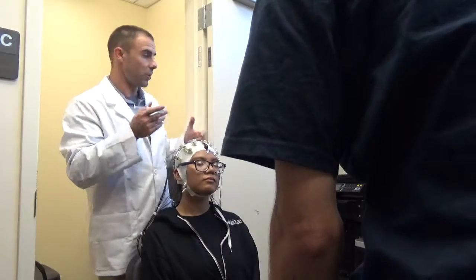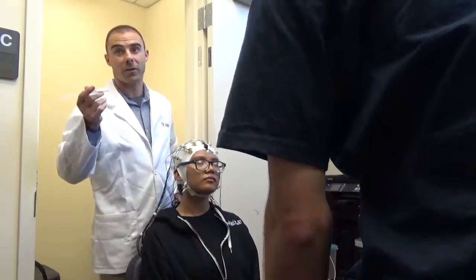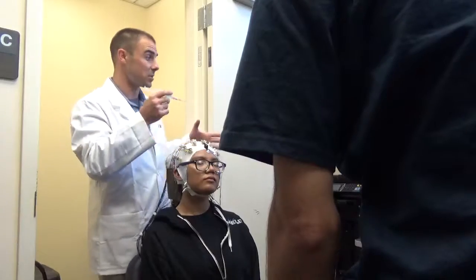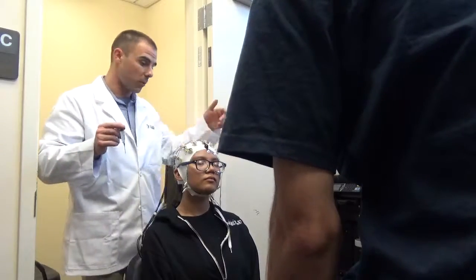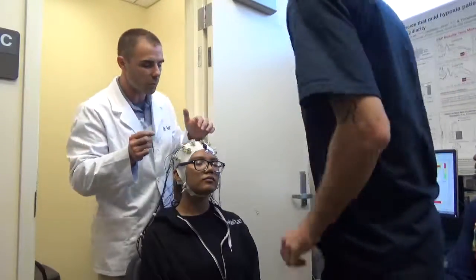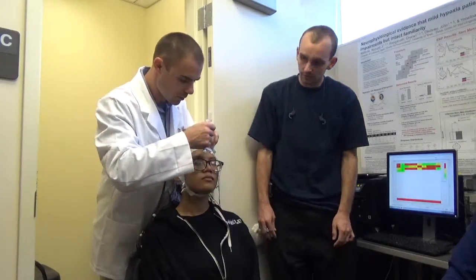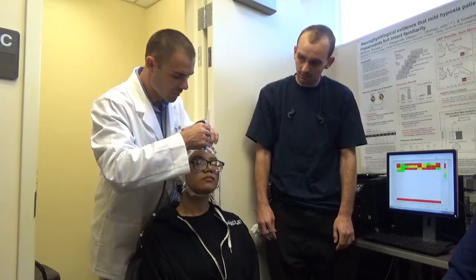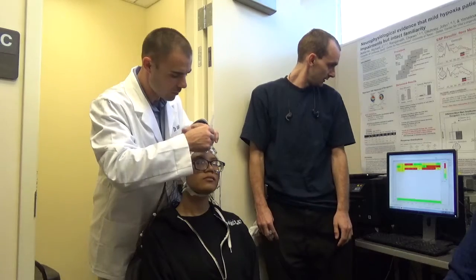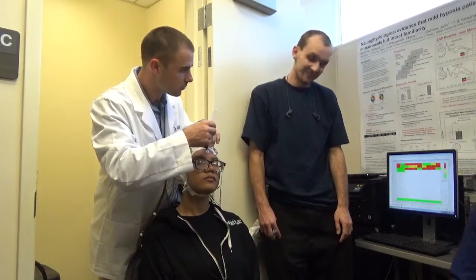And then you let it go, and every now and then it'll go back to yellow or red, and you go back, and back again. You play this little game of tag. But if you're lucky, it just stays that way. And so, why don't you grab some of these over here? But you can't play tag with ground, right? Well, kind of. Yeah, you can do that a little bit. The ground basically stays red. Oh, okay. It'll turn green. It's changing a whole bunch of those with you playing with the ground.